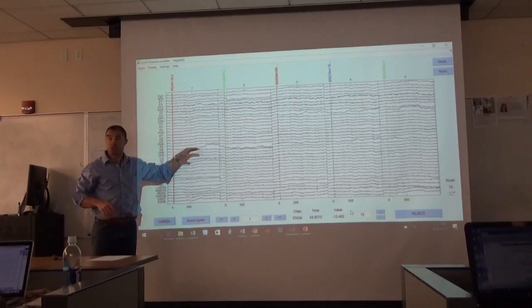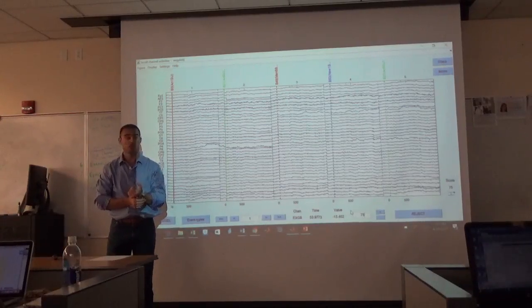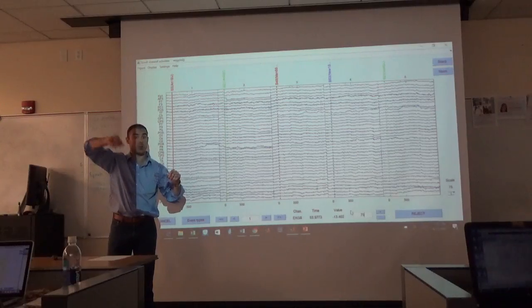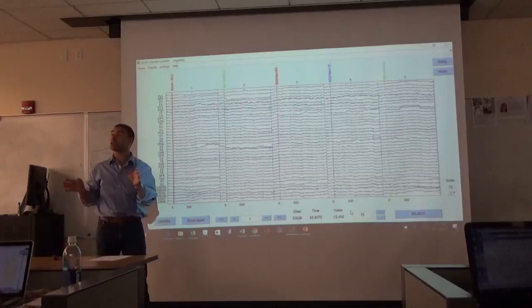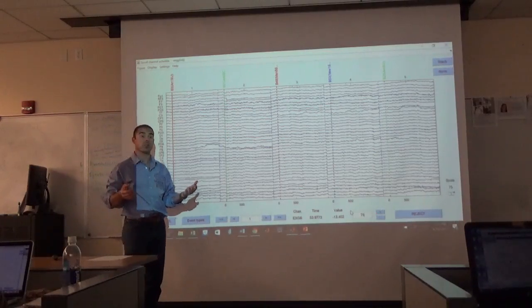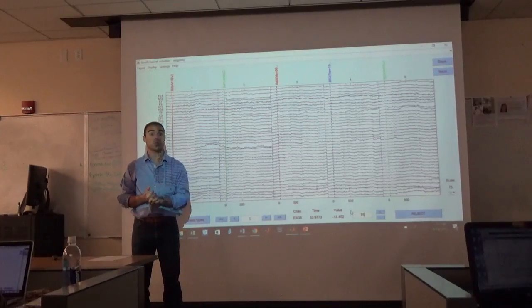So, we talked about EMG noise before, right? When we zoomed in at 46, it looked like it was much noisier, right? We zoom out, it doesn't look as noisy. That doesn't change the noise, it just changes our look. And just like most things in life, things can look a little bit differently depending on your point of view. So we just changed our point of view.